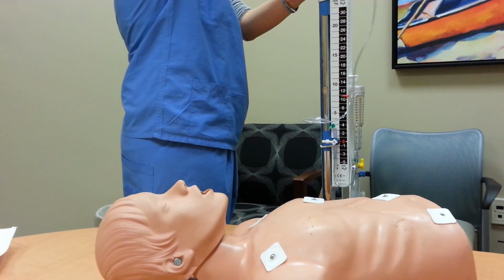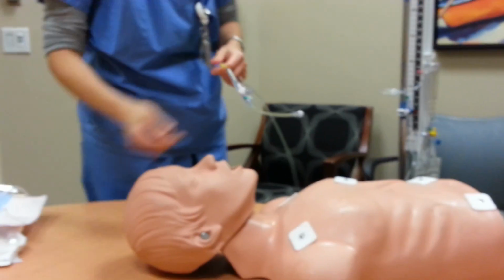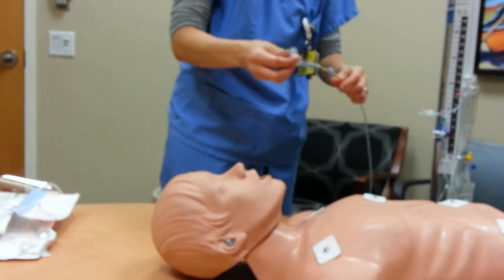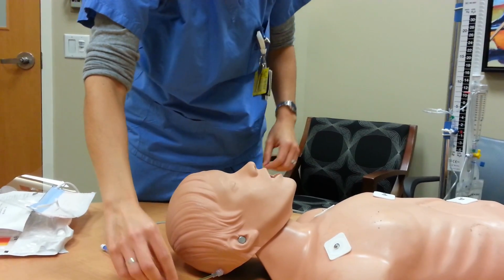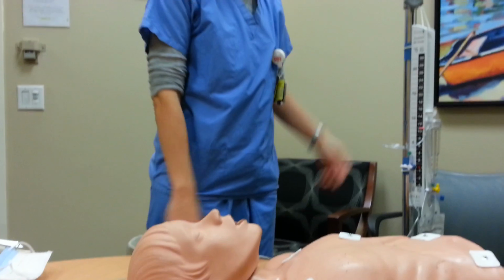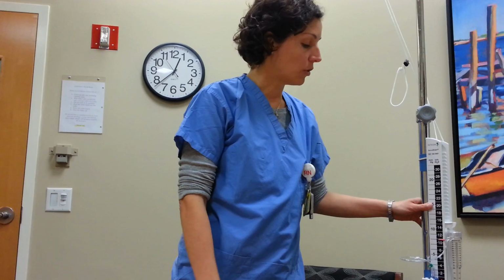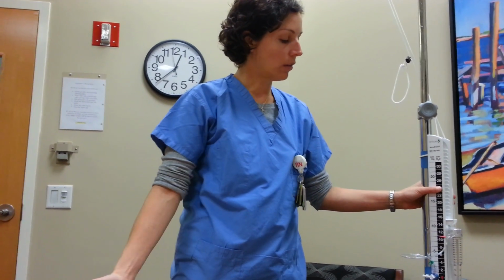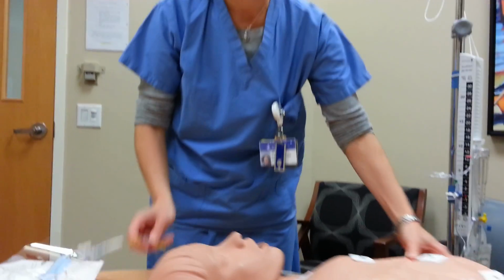This is the piece that connects to the ventriculostomy catheter that goes into the patient's head. And it will screw into the catheter like that. So this is how you facilitate drainage. The other important piece that of course this does is it measures ICP. To measure the ICP, you need to set up transducer tubing. Just like transducer tubing that you use for an arterial line or a CVP, we use the same transducer tubing, but we do it a little bit differently. There's two main differences in the way we set it up.